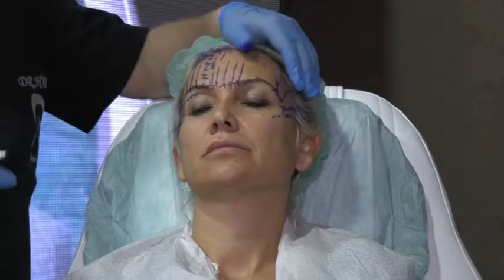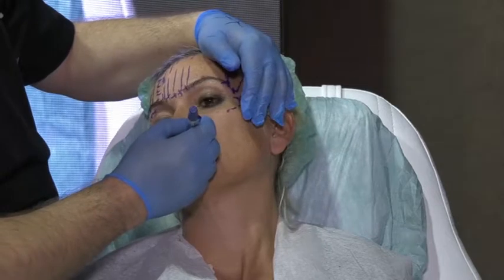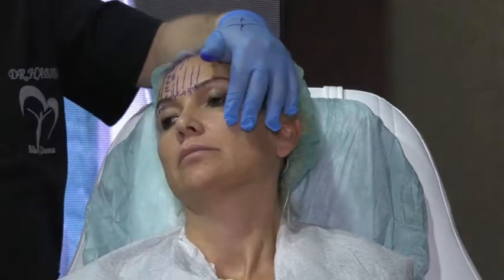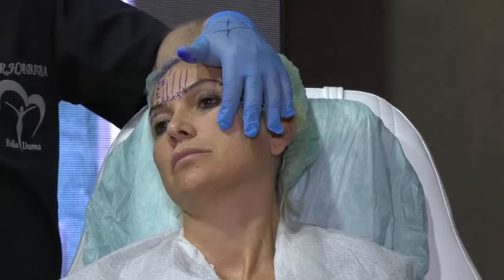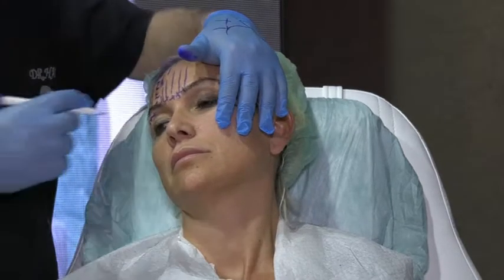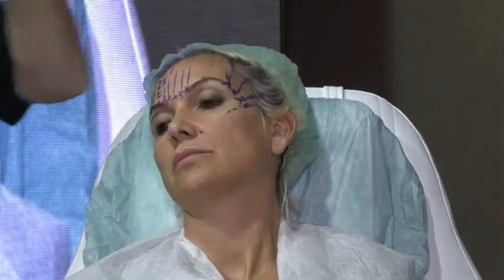Okay, first of all, where is my first entry point? I go from the base of the nose until I cross the nasolabial. Always stretch the nasolabial so it doesn't give you a false impression of 0.5, because then when you enter and do the lifting, you find yourself in the middle of the cheek. You have to know what is really 0.5 centimeter, like that.